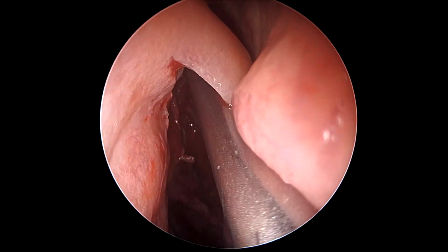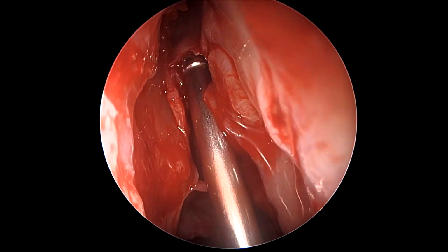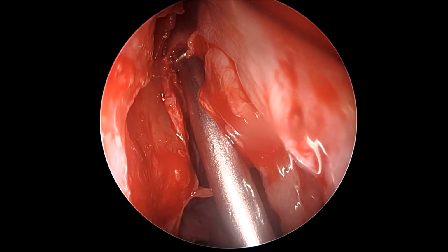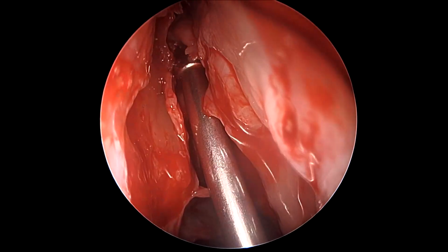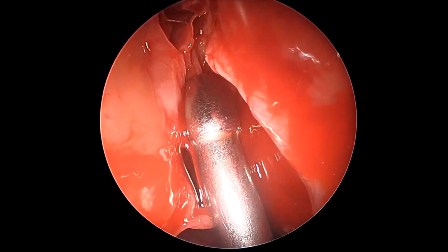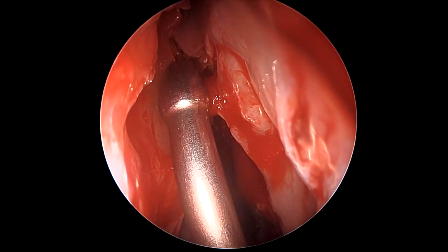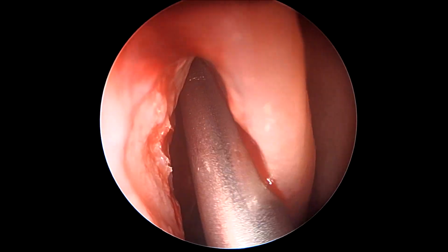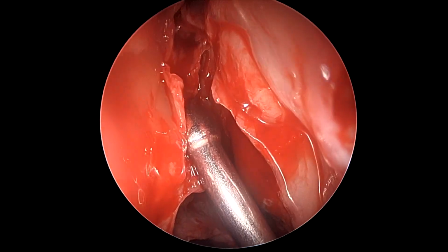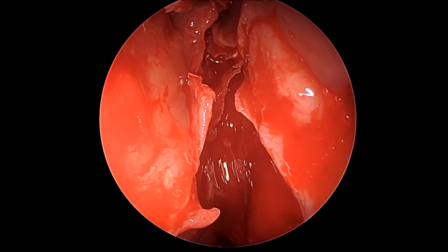Once it is felt that there is a lot of loose mucosa or loose bone inside the frontal recess region or the anterior ethmoids, then some amount of microdebrider can be used in this region to clear off the redundant bone and the mucosa. For the rest of it, a thin olive tip suction or a frontal sinus suction curette often works very well. However, the frontal sinus suction curette is a sharp instrument and can sometimes lead to unnecessary penetration of the skull base. So whenever in doubt, using an olive-tipped instrument which is gently curved is a much safer option.